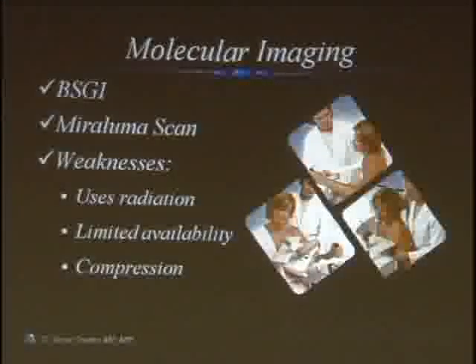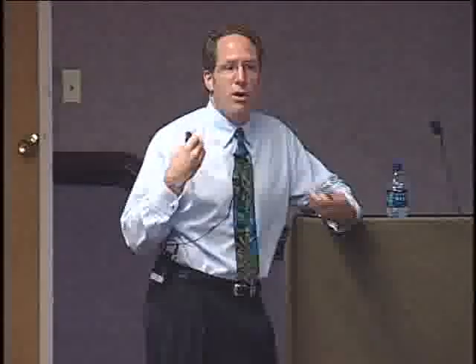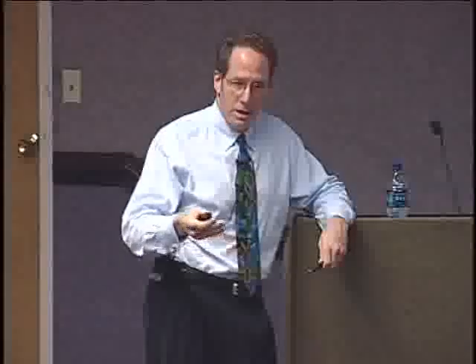One of the other problems is that it does use compression. Women don't like it. It's light compression, but try to tell a woman what light compression is. Women, you all know that we don't know what light compression is, right? So, shaking big head, yes. Okay, so even though I say it's light compression, you still want to smack me, okay? It uses some compression, and that's why I know to put that up there.